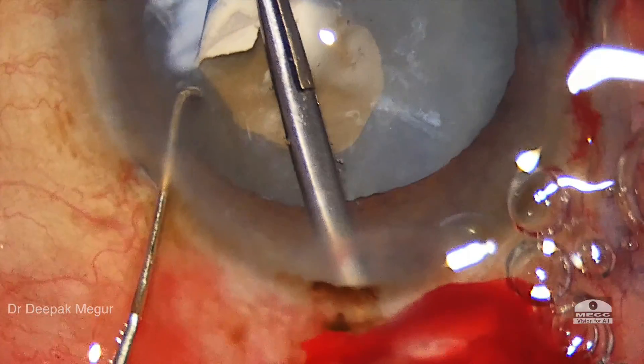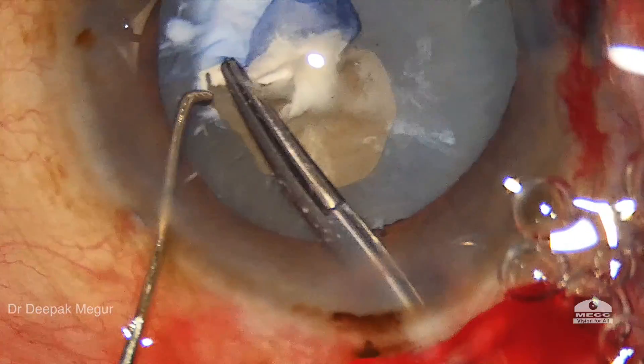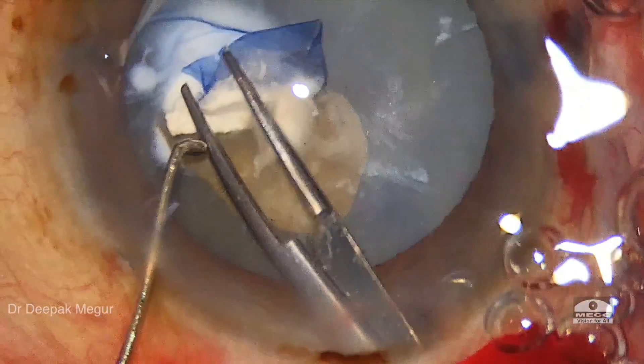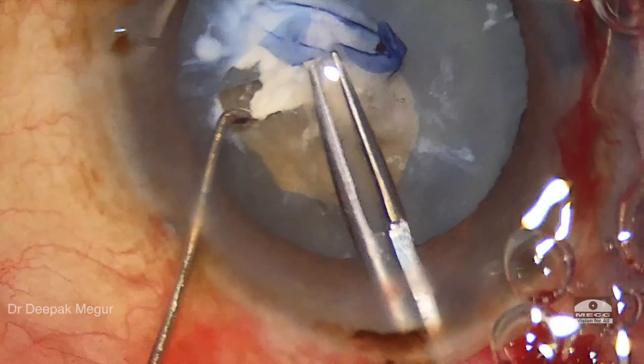I'm trying to negotiate this capsular tear around this plaque. It's very obvious that the tear is becoming uncontrolled, and it's clear that the amount of stress being induced on the zonules is very high.